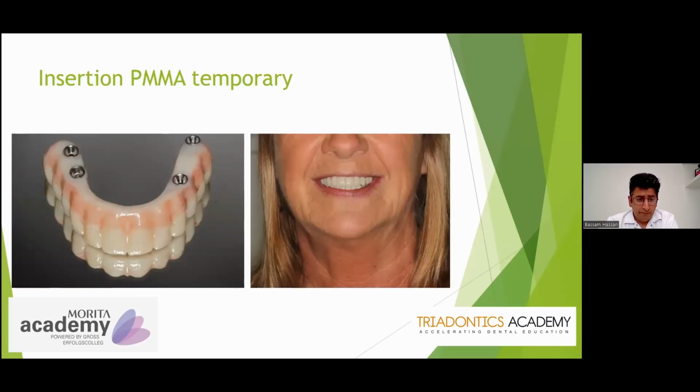This is the 3D printed temporary material, the same material used to do a temporary crown on an implant. You can print those within half an hour to 45 minutes, and then you have a full arch 3D printed. You can cure it, glaze it, color it. We prefer to use those titanium copings, and you can screw it in.